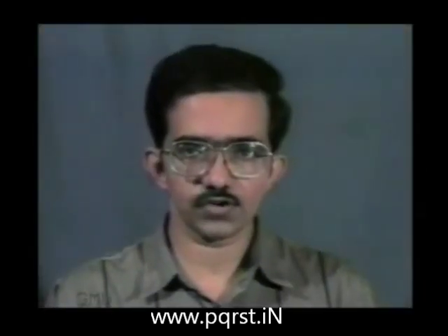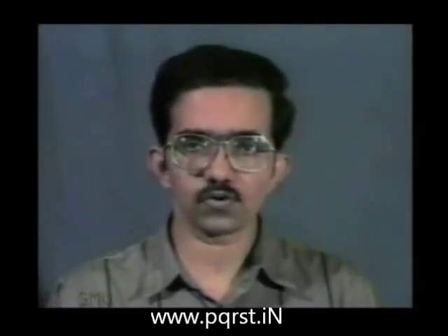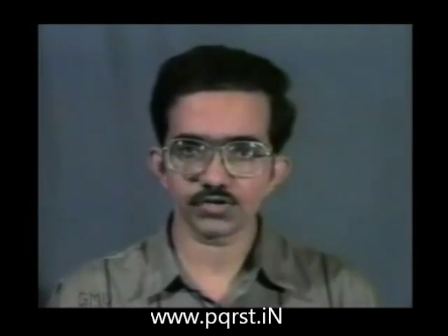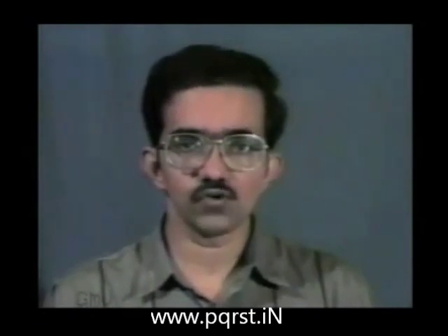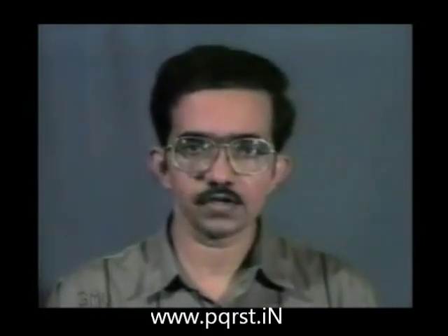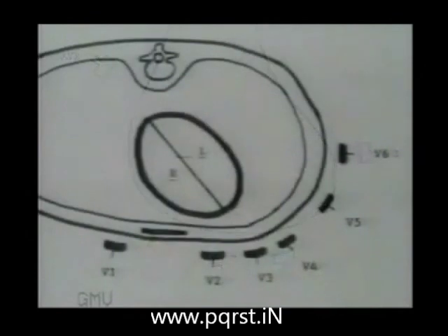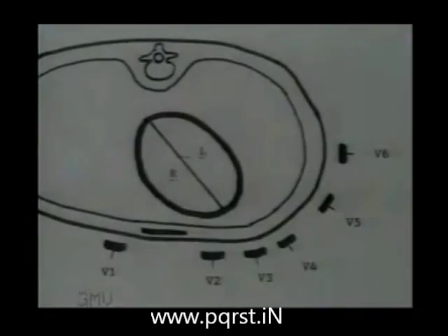The standard electrocardiograph is a recording made from 12 leads. Each lead records the electrical potential difference between a positive and a negative body surface electrode. And each lead gives us a view of the electrical activity of heart from a different direction. Six of these leads, that is 1, 2, 3, AVR, AVL and AVF, give different views in the frontal plane, and 6 chest leads V1 to V6 give the views in the horizontal plane.